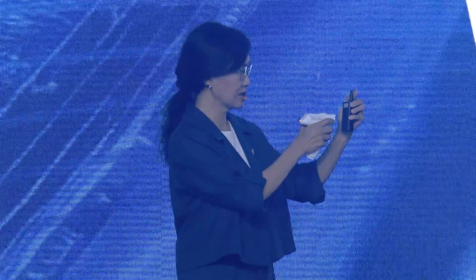So we put the shaft here, and let's say this is the eardrum. I will attach the shaft onto here. There is a mode which is on and off, adult and child's mode. When it's green, I'm ready to go. Now it's out of battery. For the shaft, I put the little tube at the end. I bring the shaft quite close. The surgeon is the one actually doing this. Once it's about 5 millimeters away from the eardrum, there is a proximity indicator telling me I'm close enough. I do not want to be touching the drum, so that it's very comfortable for the surgeon and for the patient.